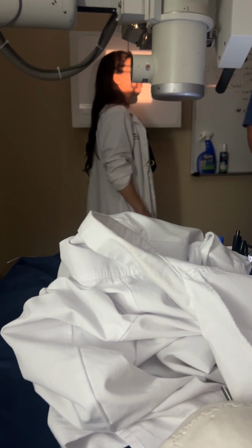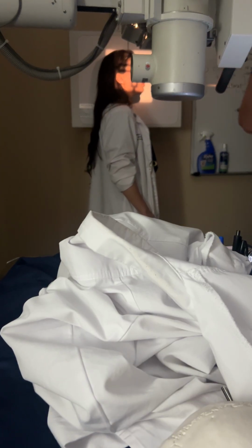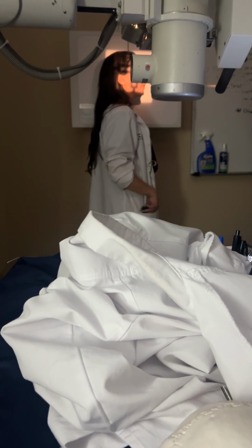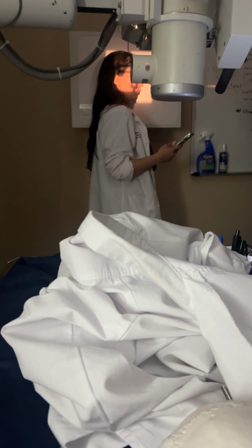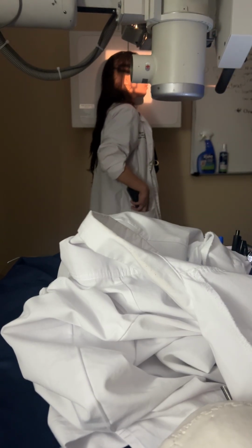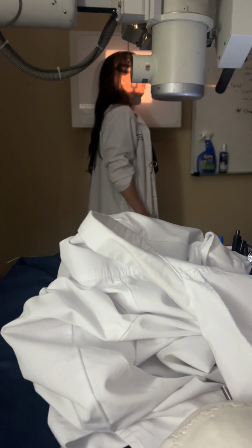Questions? So your collimation for these obviously needs to include the entire cranium, okay? Also, when you're positioning for the cranium, your collimation just needs to include the dome. Doesn't need to include all the facial bones, okay? We're just looking at the cranium, okay? What is your CR centering for a lateral of the skull?